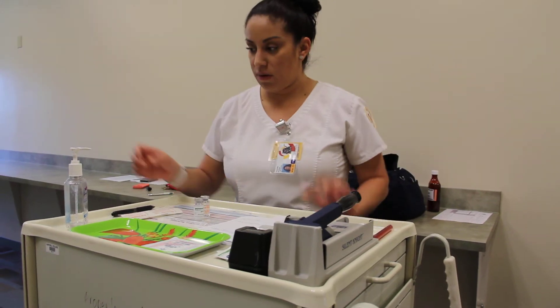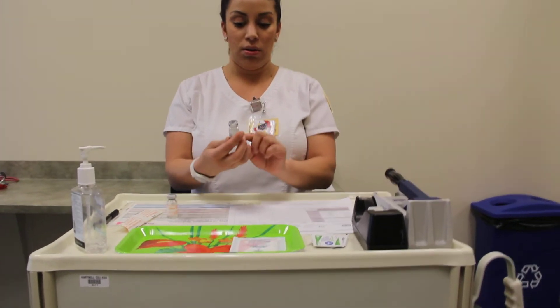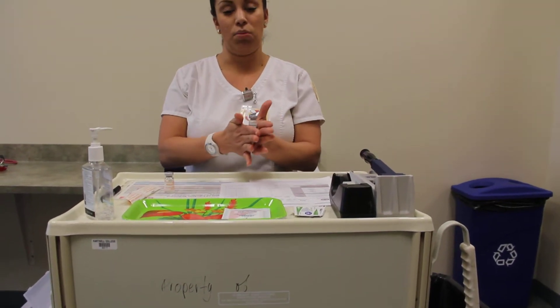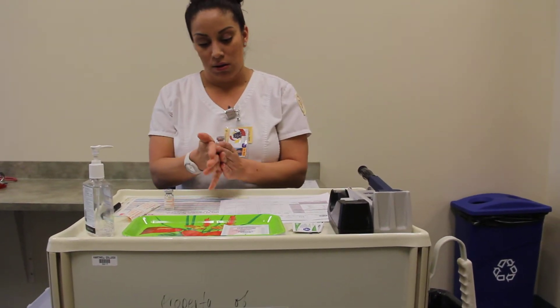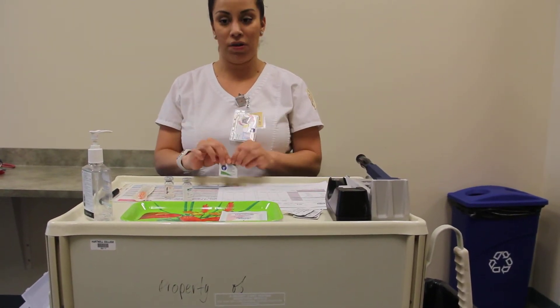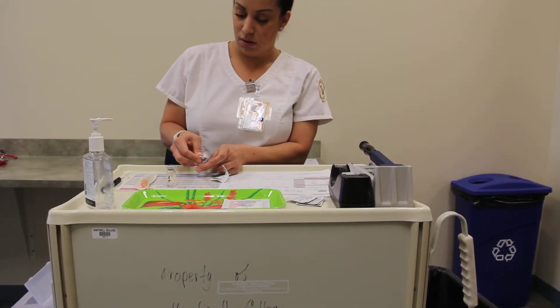I'm going to go ahead and wash my hands again. I'm going to get my NPH — it's cloudy — and I'm going to roll this insulin in my hands to mix it up. I do not want to shake the insulin, I just want to roll it to get it mixed. Then I'm going to go ahead and clean the tops of my vials really good.